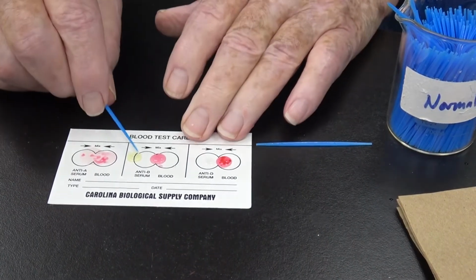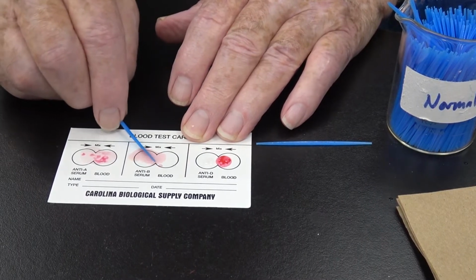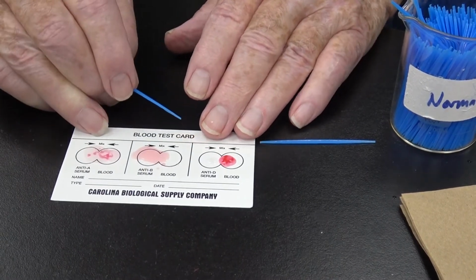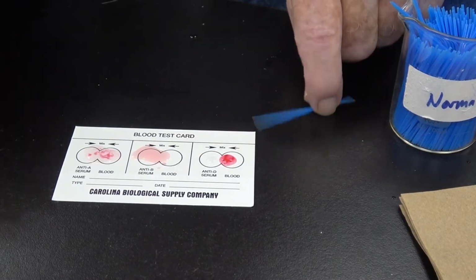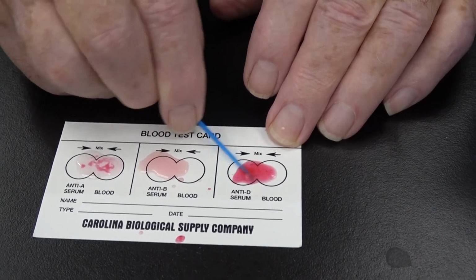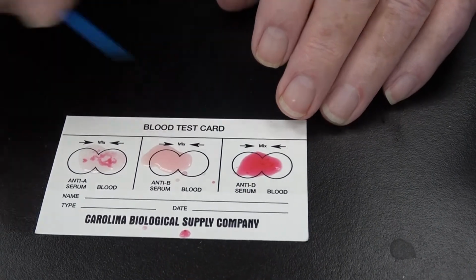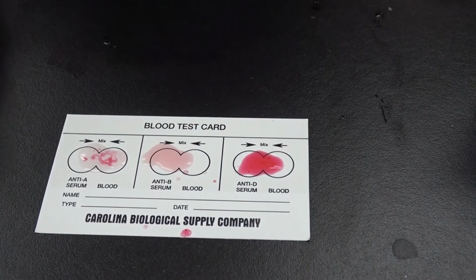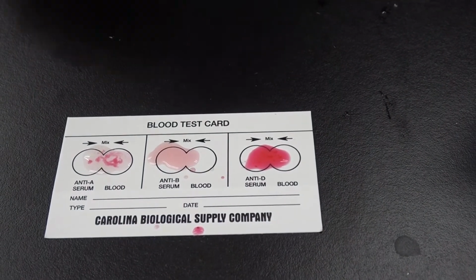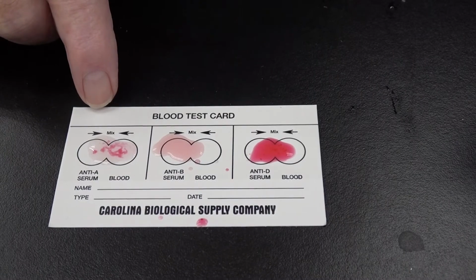And then let's try the B. If it clumps, it means you have the B antigen. It does not clump. Let's try the RH factor, the D antigen. It doesn't clump. So what this card represents, after about 30 seconds, is type A blood because it clumped only on the anti-A serum.